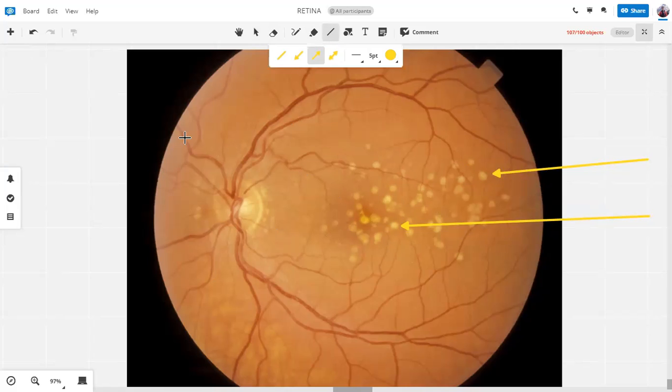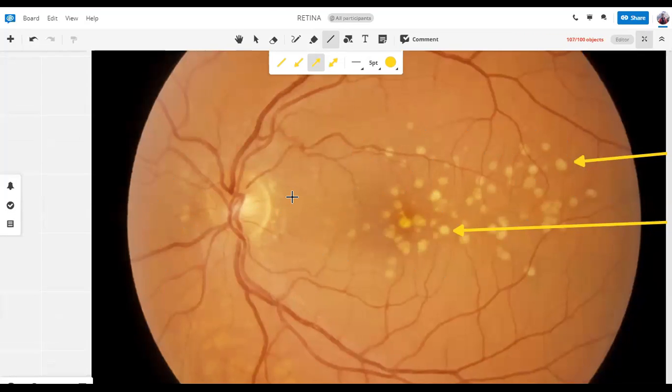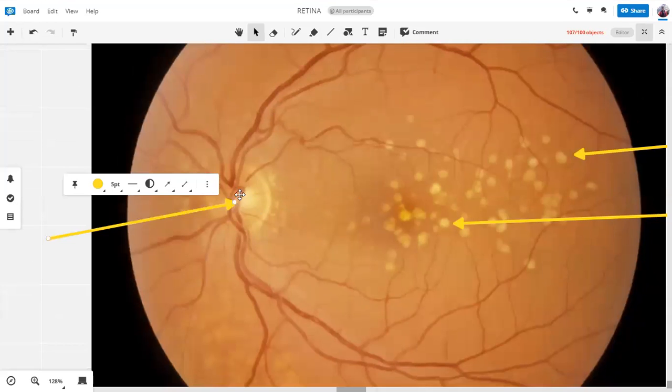और क्या है? Optic disc के around भी है. Optic disc के पास. Are these the same things? Look at this discoloration जो आप कह रहे हैं, थोड़ी बहुत है. Are these the same? Not the same things, right? You can see that these spots, they're circular, well demarcated. This can be something different. Okay, कुछ भी हो सकता है. These can be some hard exudates. तो yes, something wrong over here.